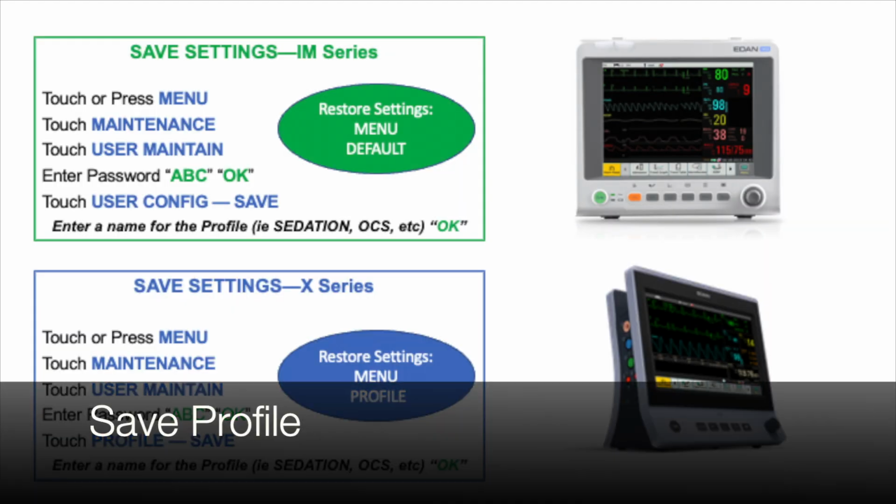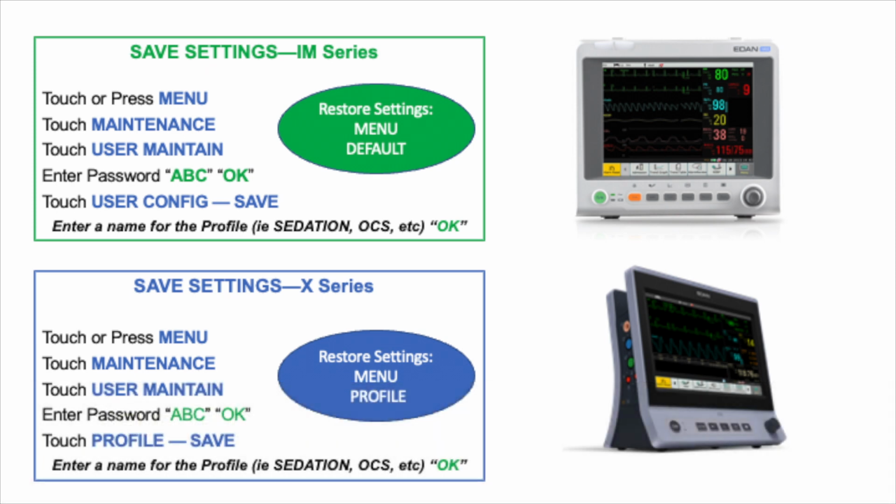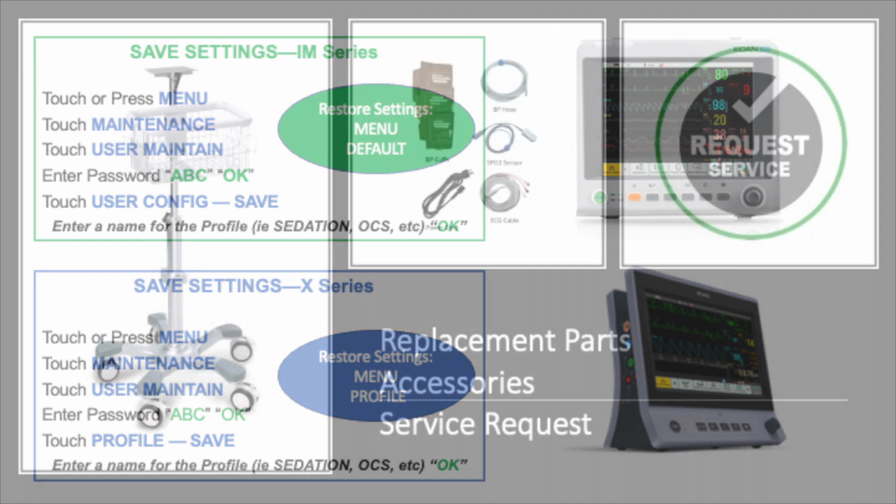Save the settings. This is an important step. Save the settings by following the instructions as shown for the specified monitor. The monitor will come back on with this default profile each time. If changes are made to your setup, you will want to follow this process again. However, when it asks for the name of a profile, enter the exact same profile name and you'll be prompted to overwrite the previous saved profile.